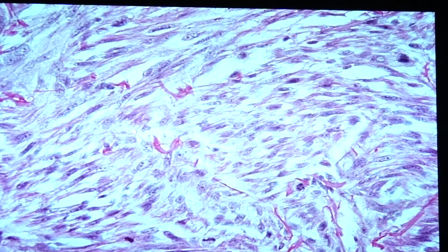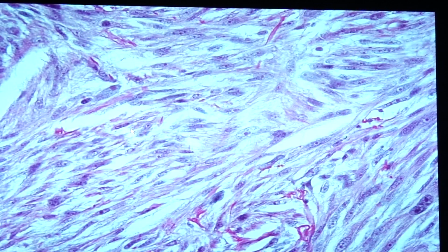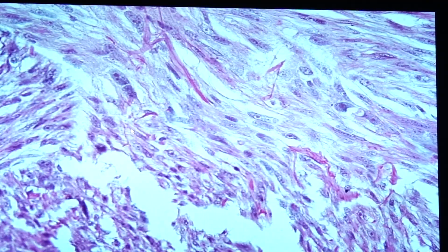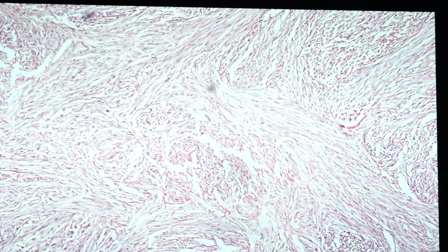So let's go to the high power magnification. These are composed of spindle cells. They have moderate pleomorphism. Here you can see the presence of large nuclei, elongated, with prominence of the nucleolus or nucleoli. So this would be the presence of fibroblasts. The pink would refer to the dense collagen. So this is fibrosarcoma.